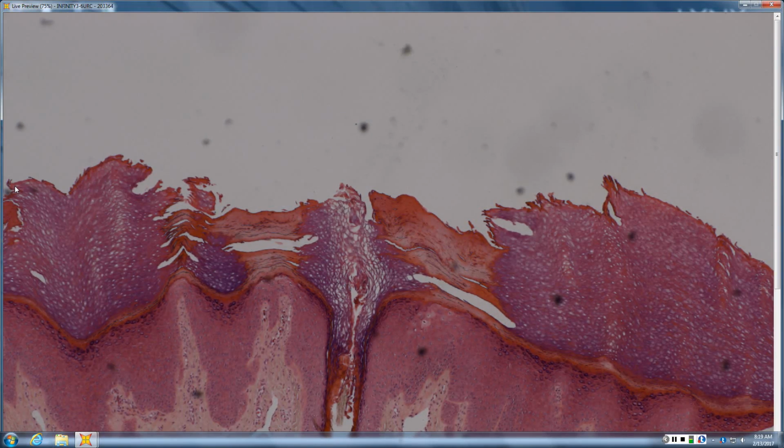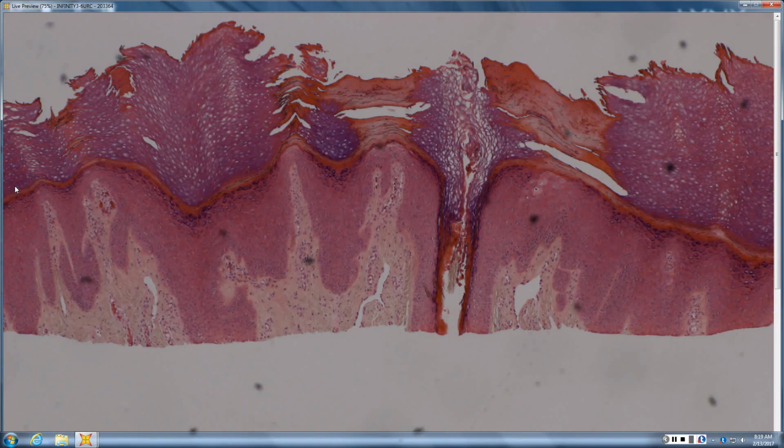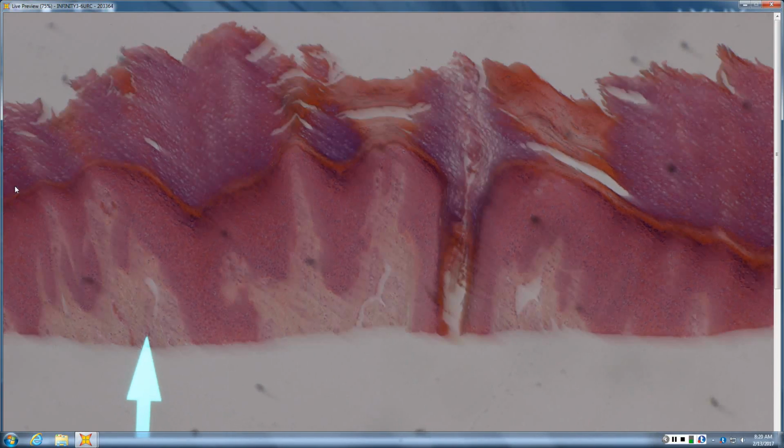It's a pseudo-acral site. Either the person has palm-like skin from rubbing, or the original view did not show the palm. So you are correct. You have a stratum lucidum and a thick corneum that looks like acral skin, but you have a hair follicle, so it is clearly, as you said, pseudo-acral or hairy palm appearance. You have areas of pink corneum. You have areas of eosinophilic necrosis of the granular layer, which is always a fingernail at work. And you have angiofibroplasia with vertical streaking of the papillary dermal collagen, so that's all prurigo.